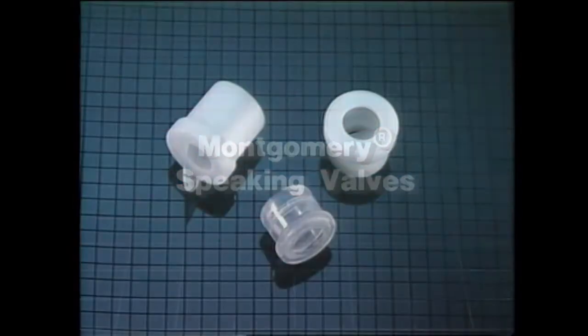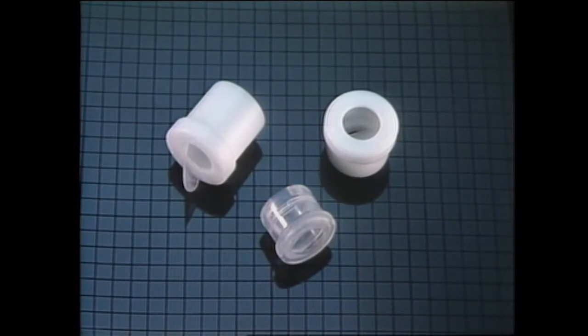The Montgomery speaking valves are designed to allow tracheotomy patients to vocalize without the need for finger occlusion. All valves provide one-way airflow using a thin silicone-hinged diaphragm which opens on inspiration and closes on expiration. All Montgomery speaking valves are noiseless, easily cleaned, durable, and offer a unique cough release feature, eliminating valve blowout following a forceful cough or excessive airway pressure.